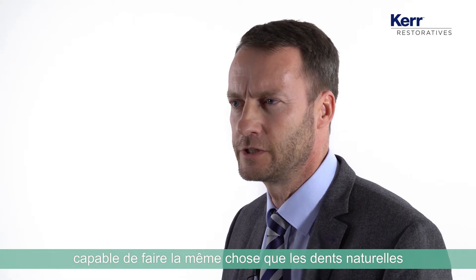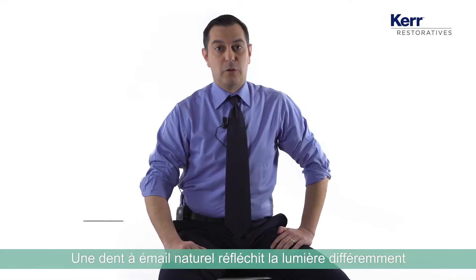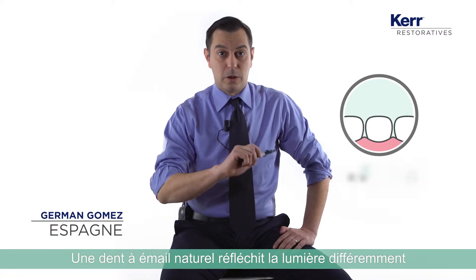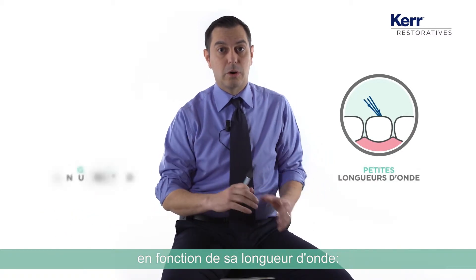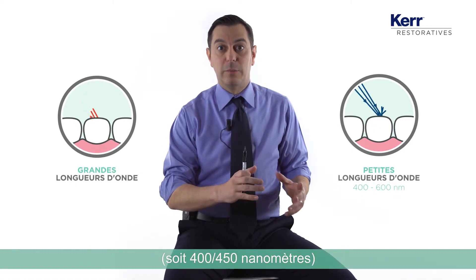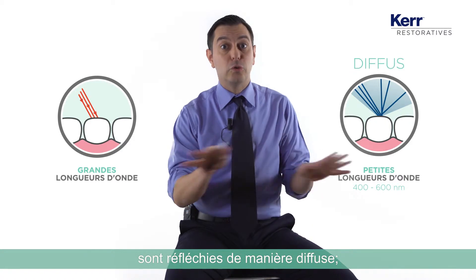We have to find a material that is able to do the same thing as natural teeth do in terms of reflecting the light. In a real enamel tooth, light is reflected differently whether the light comes from a short wavelength or a long wavelength. Short wavelengths, like blue — 400 to 450 nanometers — are reflected in a diffuse way.